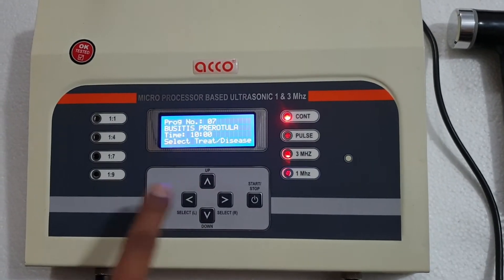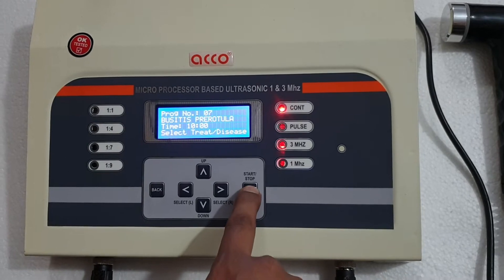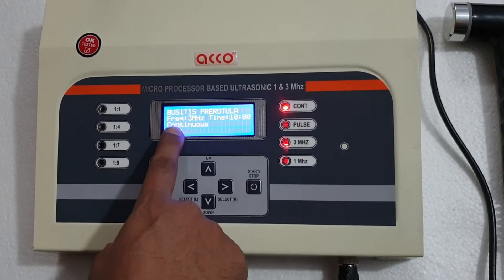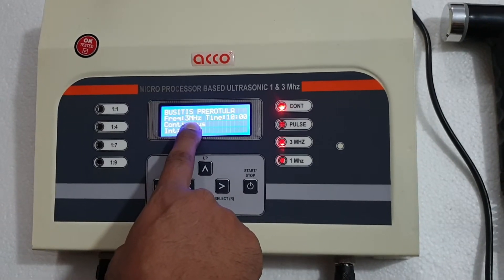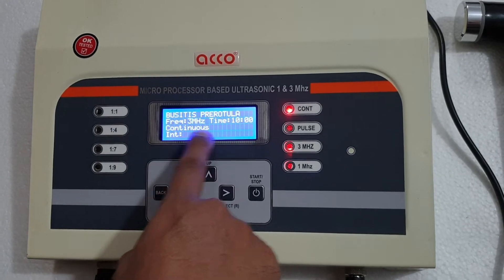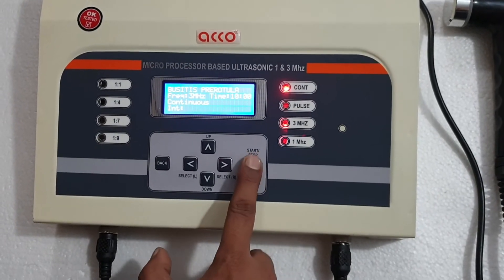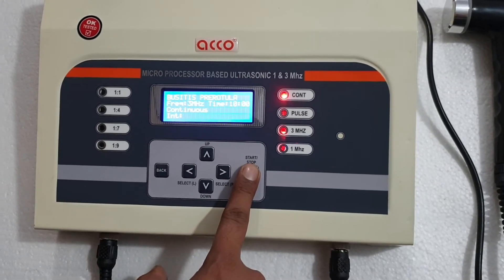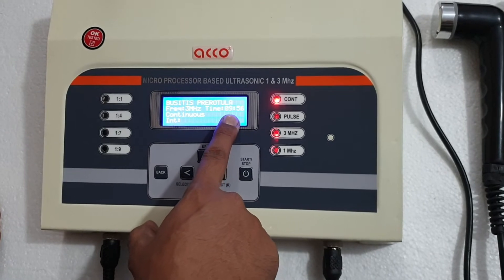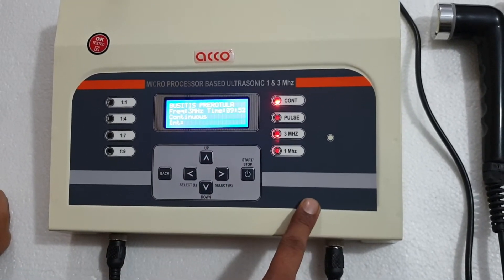After setting the program as per your requirement, you can press start. This shows that the frequency is 3 megahertz, timer will be 10 minutes, and on continuous mode. When you press start, the timer has started, so the machine is working now. When the timer gets complete, it will give a beep sound.